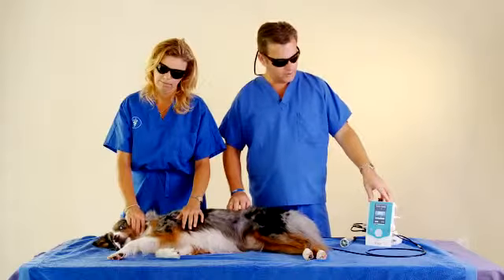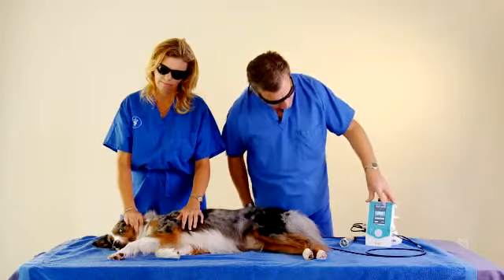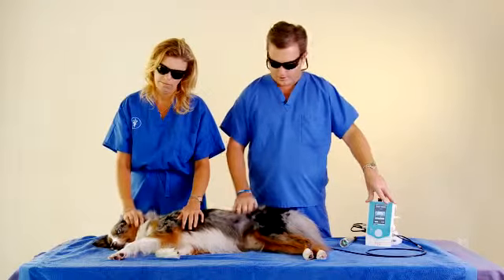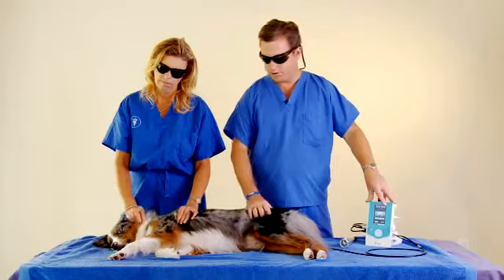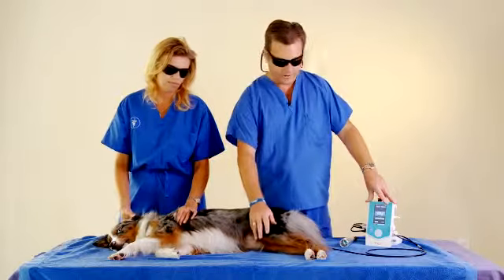Okay, today, so this section we already have the laser on. It's already had the key put in to get into the protocol. I've already hit canine. And today we have Joker with us. He is a 6-year-old Australian Shepherd. And this is, again, a training video. This isn't real treatment. So we're assuming the dog has some degenerative disc issues and an arthritic stifle.